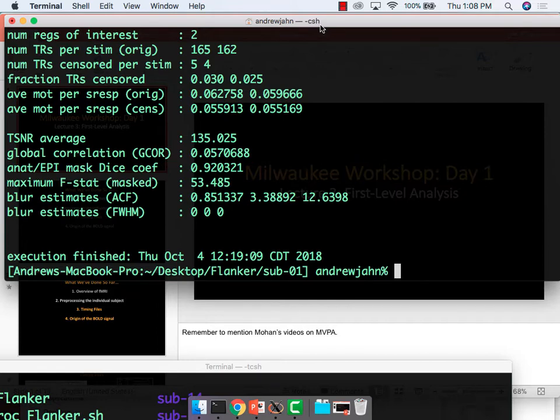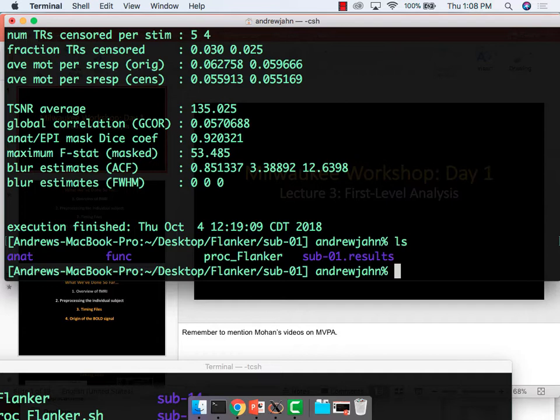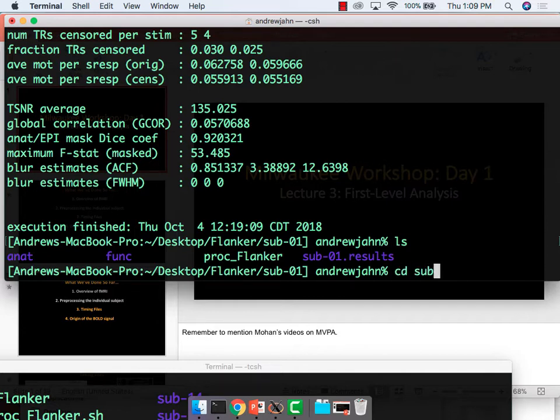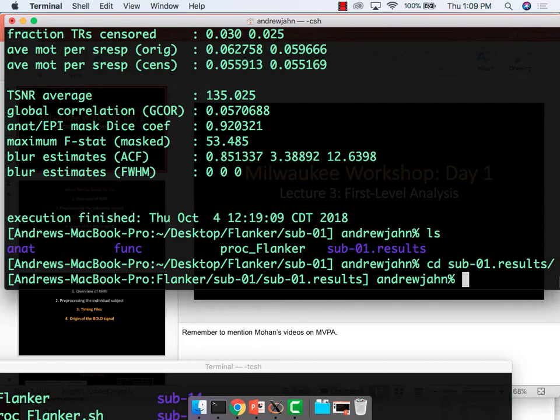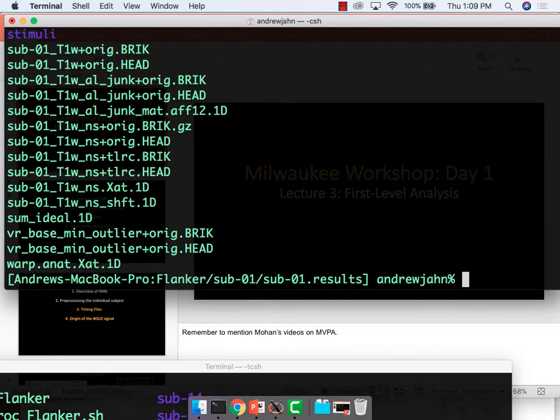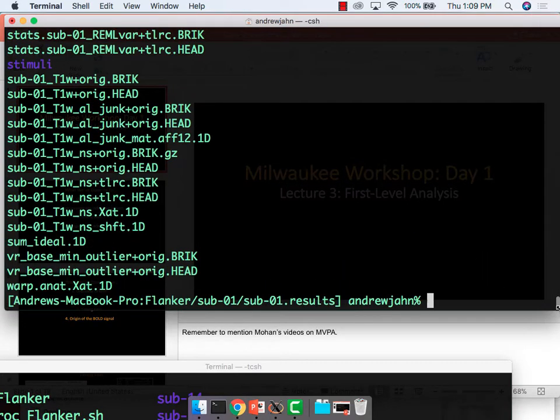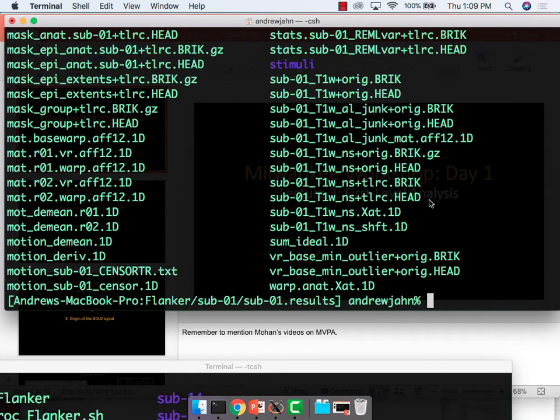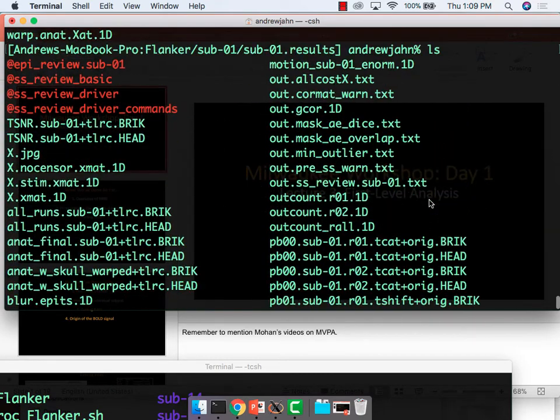We're going to be mostly looking at different parts of the processing pipeline. So you should still be in the sub01 directory. And if you type ls, what this script did was create a new directory called sub01.results. If you re-logged in, you're in the home directory. So go into flanker, sub01, type ls, so that we're all on the same page here. Anybody need time to catch up?